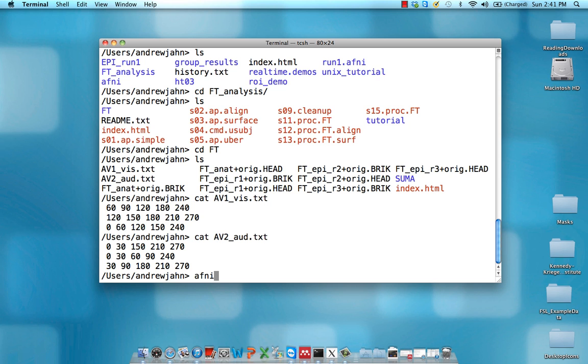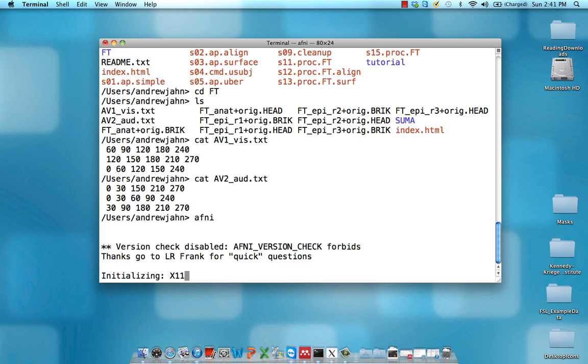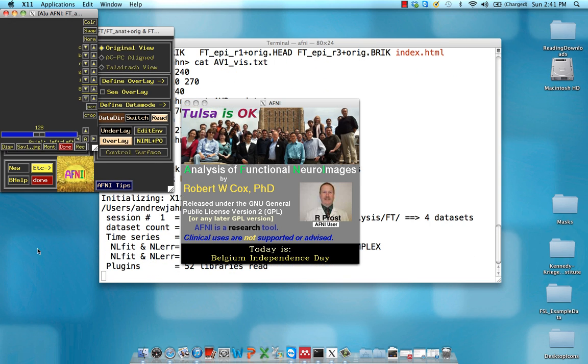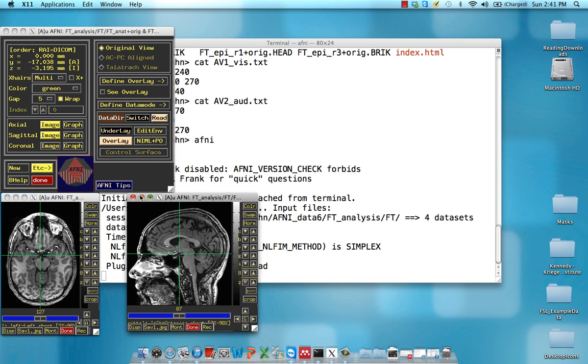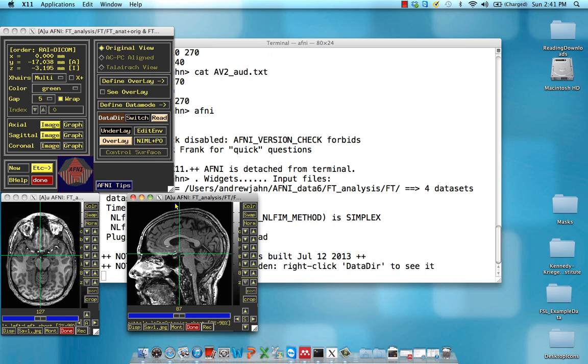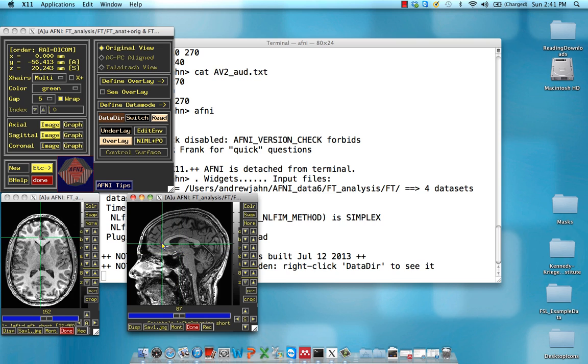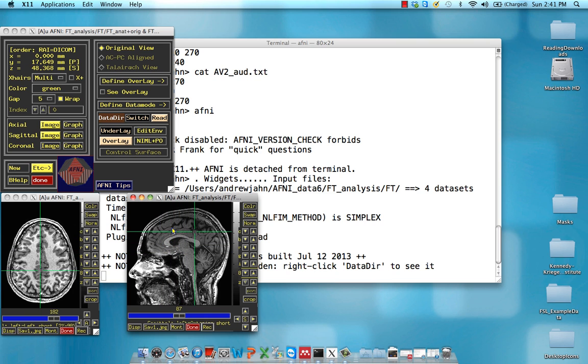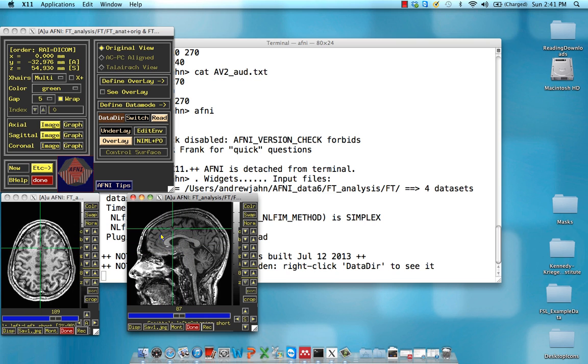Lastly, just open up AFNI to take a look at the data. It's going to automatically load this anatomical dataset. Nothing too surprising there, just make sure it looks okay.